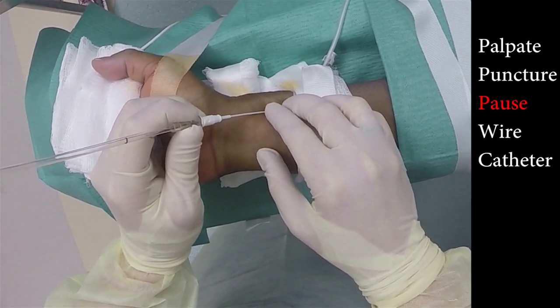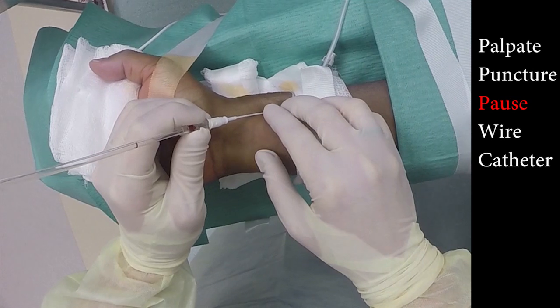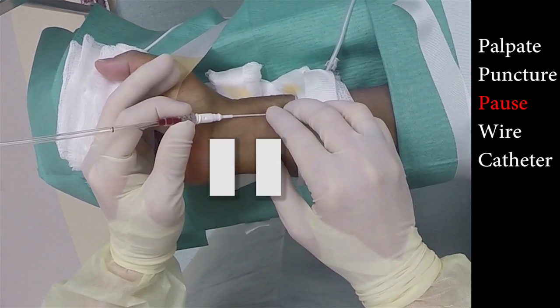Step three: pause. This begins once puncture of the artery has occurred and blood begins to amass in the clear plastic chamber behind the Arrow kit.